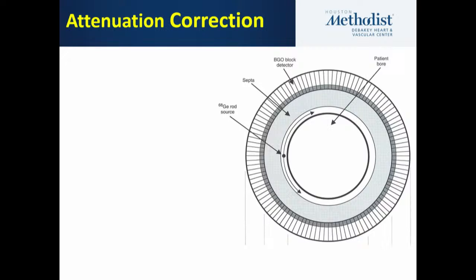And why is that? There are many physics reasons, and I don't want to bore you with all the physics, but one of them: I told you there are two photons, right? One photon could be coming from a very anterior part of the heart, let's say the RV, and it will just need to travel a tiny bit in the body and then in the air.